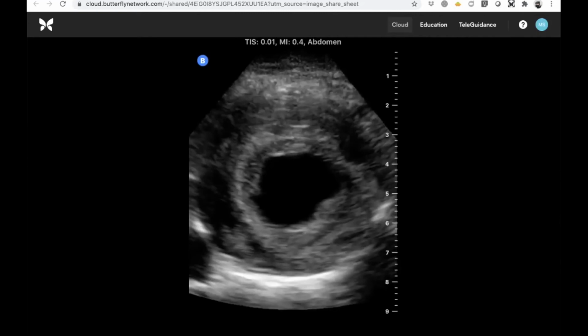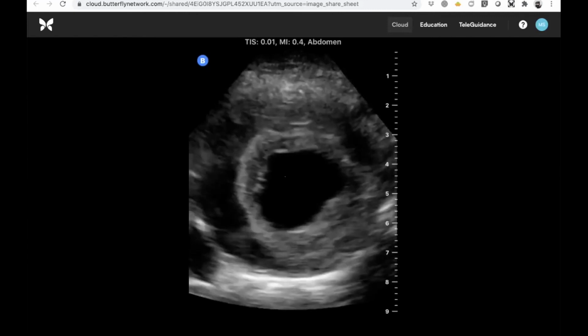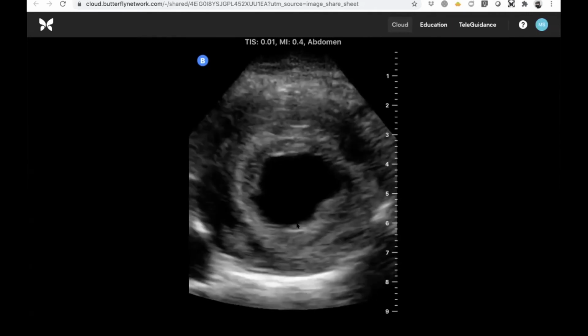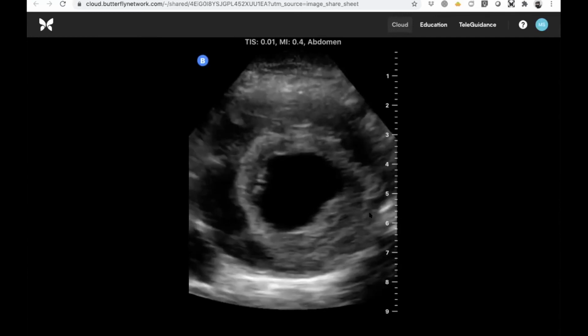And then color flow, right? If you want to go ahead and see if this is a vascular structure, I do think it's pretty clearly pulsating, but if you're able to see color flow in the lumen, no color outside, or who knows, you might see some color leaking out this way right here, making you think it's ruptured.